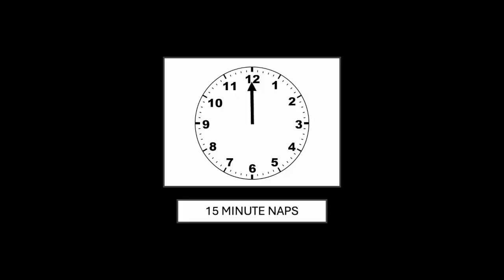When you have a clock, it takes 60 minutes for the minute hand to go completely all the way around. So if you take 15-minute naps, and you just look at the clock every 15 minutes, you'll see the 12, then the 3, then the 6, another 15-minute nap later you'll see the 9, and then after another nap it goes to the 12. And so you're able to accurately depict, just from seeing that it went from the 12 to the 3 to the 6 to the 9 and back to the 12 again, that the minute hand is actually going in the right direction.